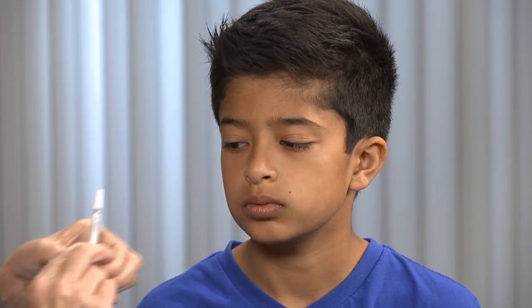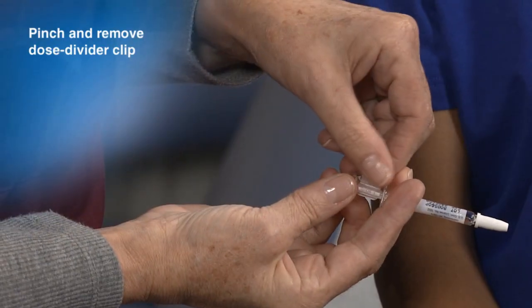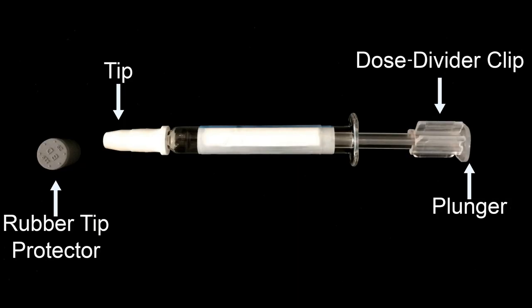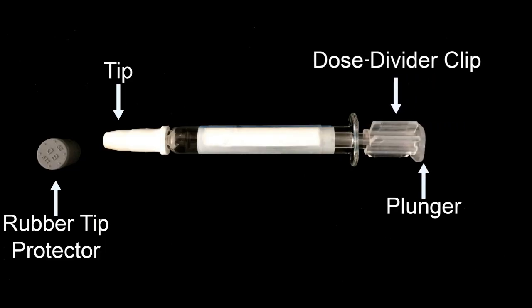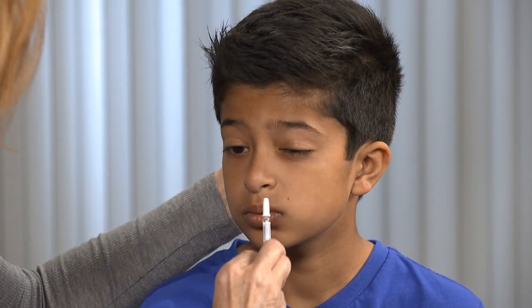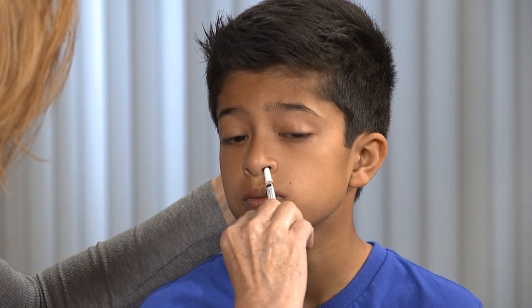Remove the sprayer from the patient's nose. Pinch and remove the dose divider clip. The dose divider clip prevents you from administering the entire dose into one nostril. Administer the remaining vaccine in the other nostril.